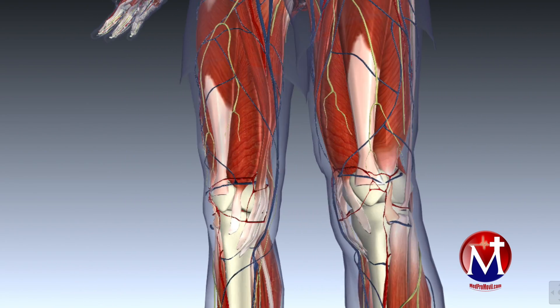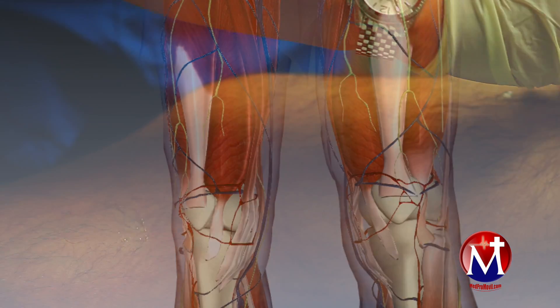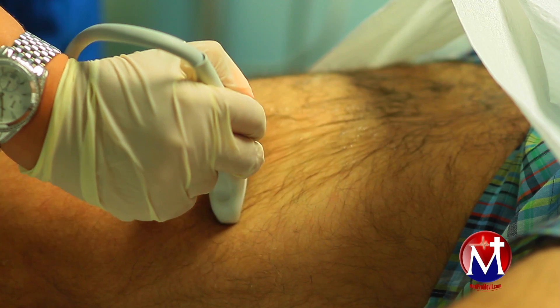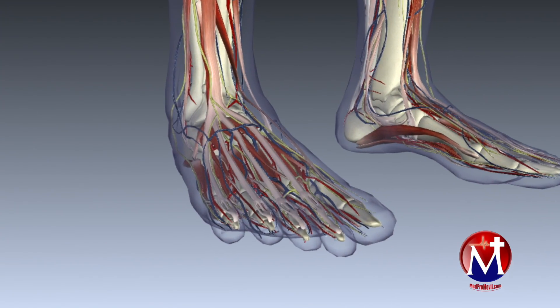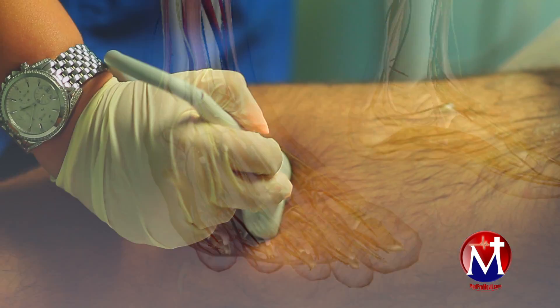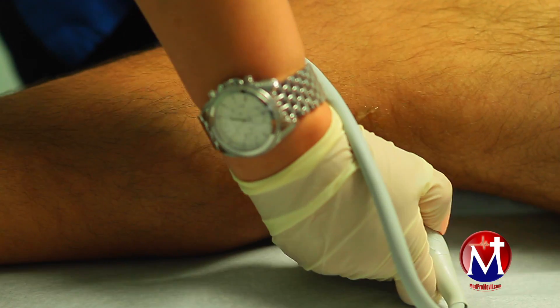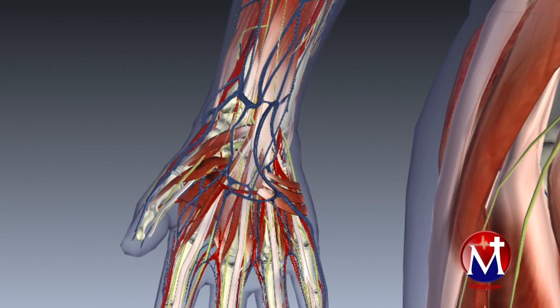Lower extremity Doppler arterial evaluation is performed from the iliac arteries, through the tibial vessels, and even extended into the foot, while the upper extremity ultrasound can be performed from subclavian arteries down to a patient's wrist.